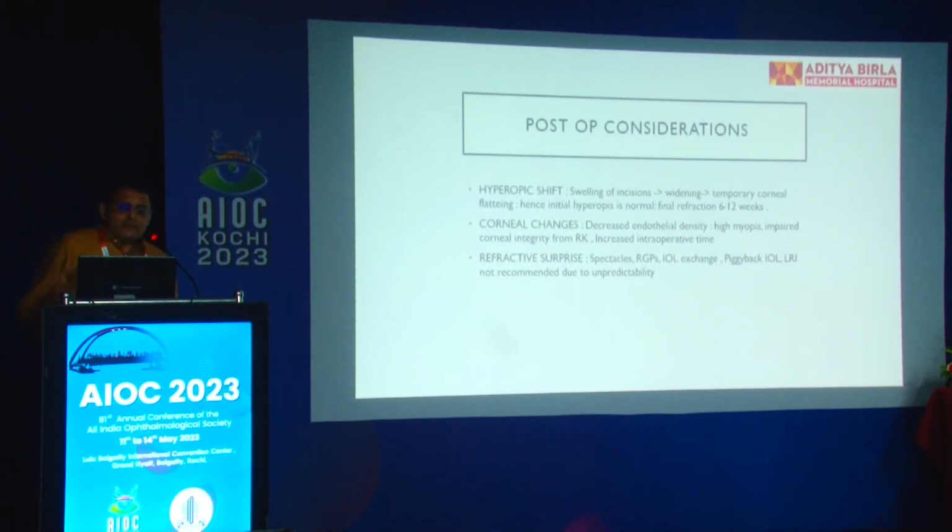Do not decide to redo the surgery or break this news to the patient. Keep looking at the endothelial density, because these are high myopic cases with impaired corneal integrity from RK. And post-surgery refractive surprises can be tackled by spectacles, RGPs or IOL exchange.